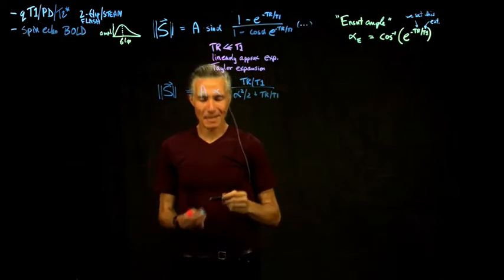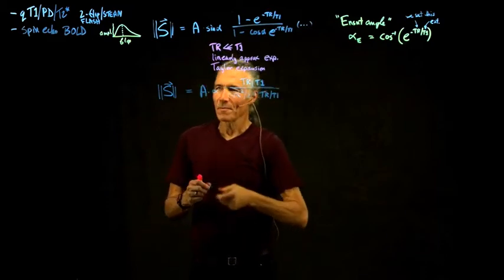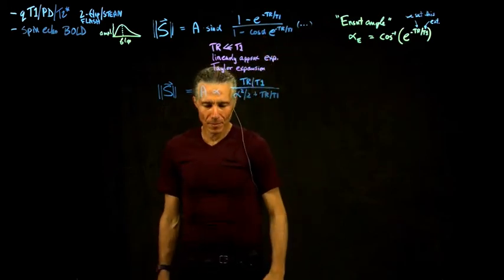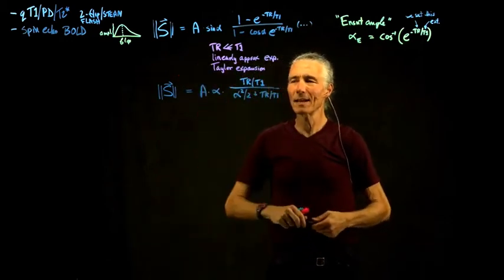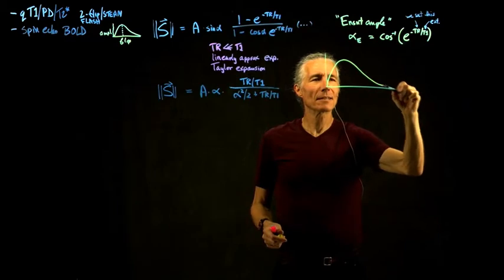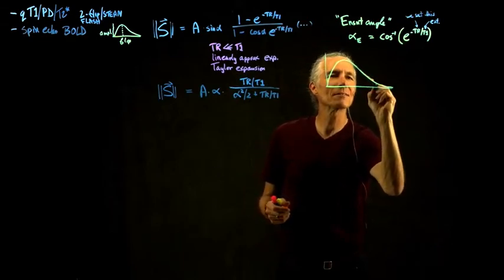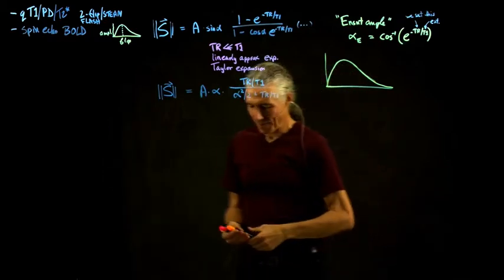And so, like I said all the previous years, demonstrating my mathematical naivete, it's amazing that this thing is equivalent to that thing. It doesn't even really look much like it. But if you type these two equations into MATLAB and plot them out, you'll see that the first equation and the second equation look like the same thing. As the flip angle increases, you start to barely see a little bit of a difference between them, but they're amazingly similar.